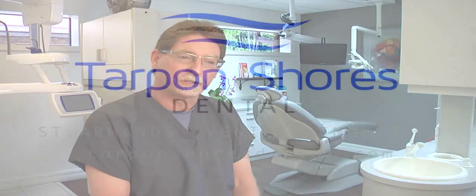After that design is finished, then we use a second machine to take a block of porcelain and then almost magically carve that crown from that block of porcelain while you wait, and many times while the patient is watching the process. At the end of that, we fit that crown just like any other crown from the laboratory and bond that crown in, one visit, and we're done.